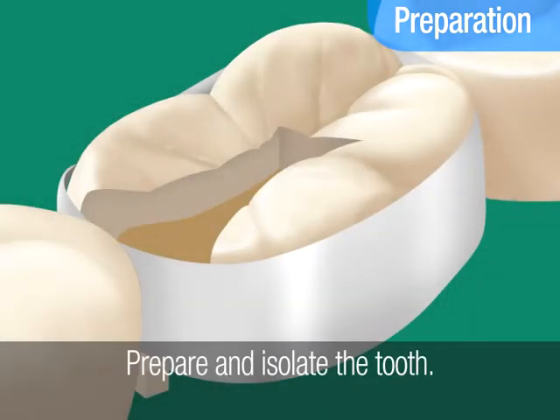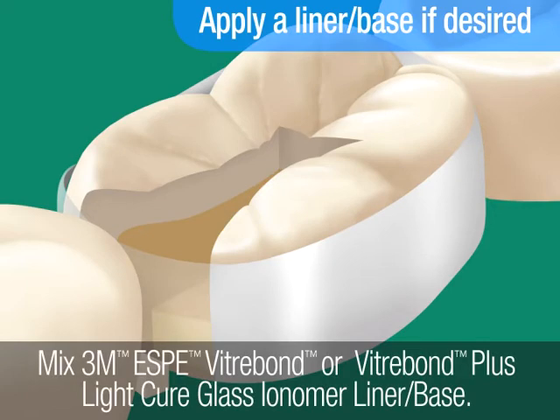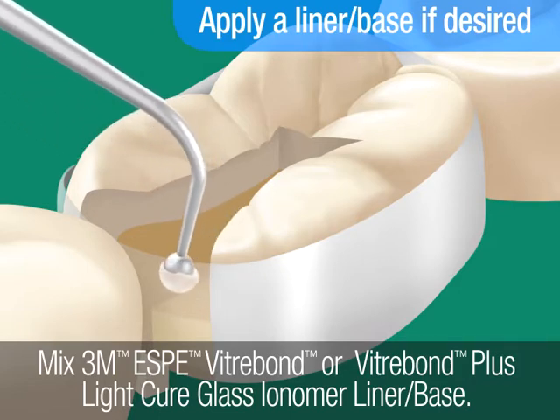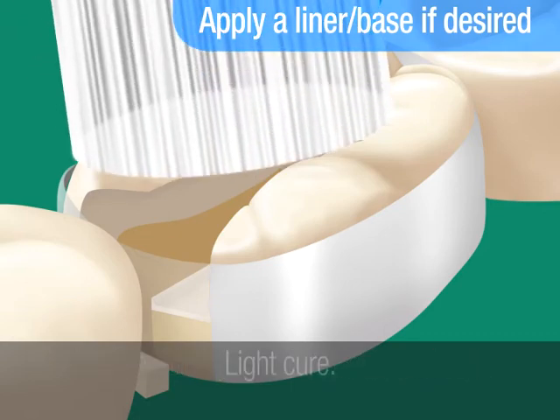Prepare and isolate the tooth. To help protect against microleakage and further reduce the risk of postoperative sensitivity, you may choose to apply a liner base. Mix 3M ESPE Vitrobond or Vitrobond Plus Light Cure glass ionomer liner base. Apply a thin layer to the dentin surfaces and light cure.